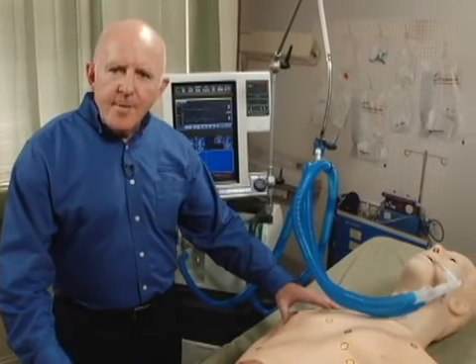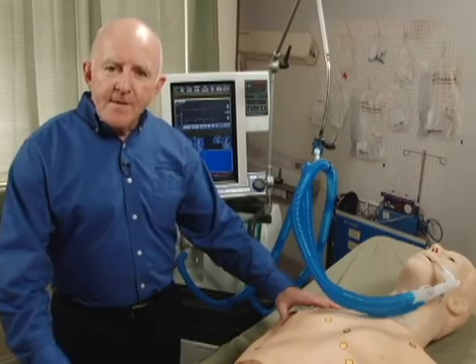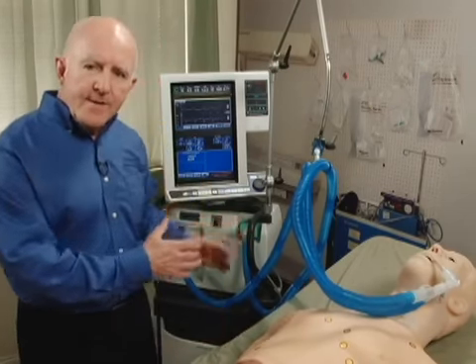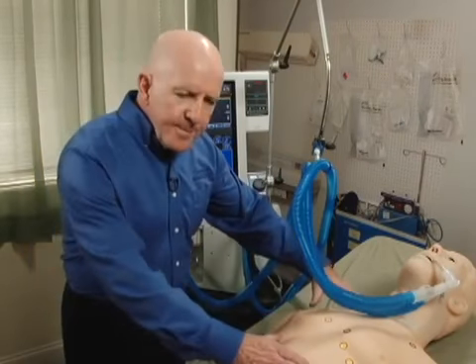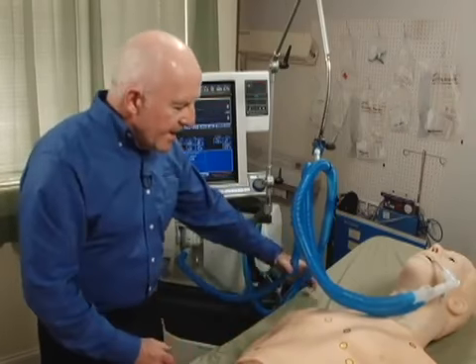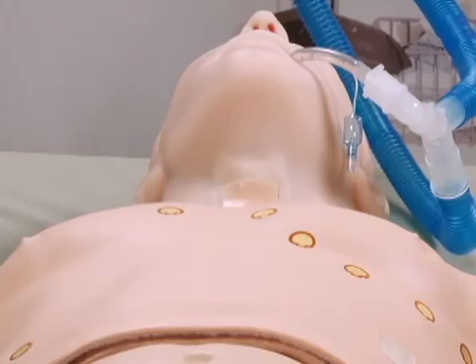What we've made is a compartmentalized lung, not springs and bellows, which results in very accurate, realistic waveforms on the ventilator in both resistance and compliance settings. Probably the first thing to note is that the dynamic lung model is completely contained within the chest of the 3201, not a piece of adjunctive equipment within the ventilator circuit.